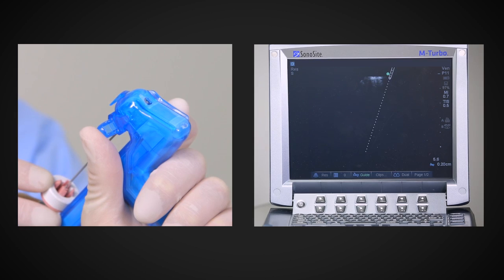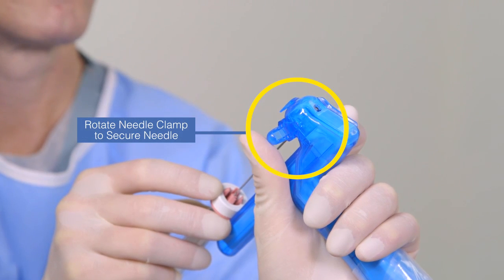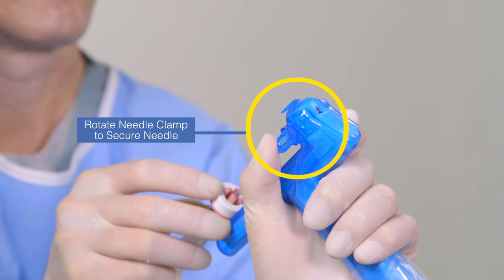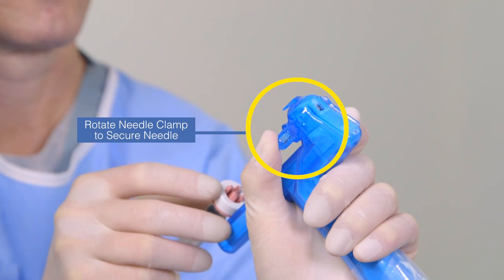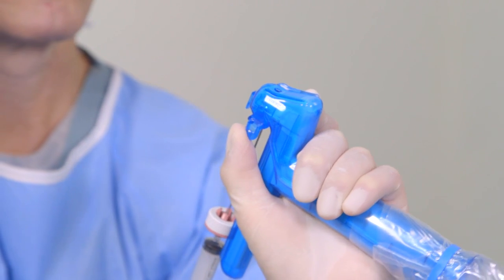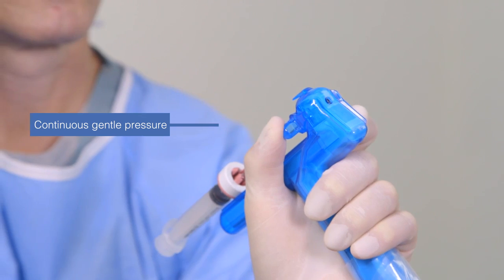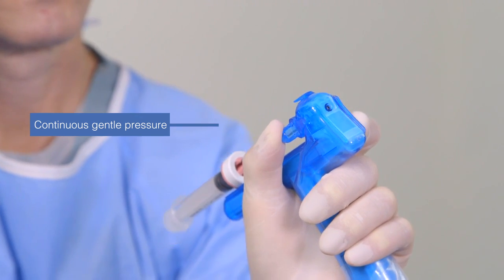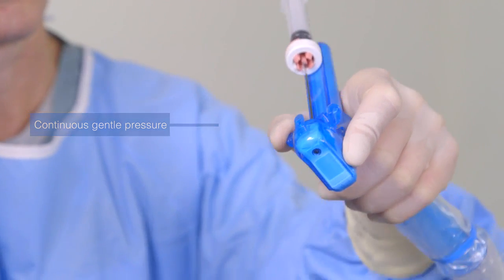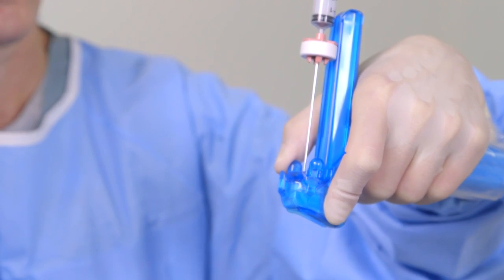At this point, retract the needle slowly until the virtual needle just barely disappears from the sonogram. Then secure the needle in place by rotating the needle clamp backward with your thumb to the closed position. Check to be sure that the needle tip is not protruding from the bottom of the sterile shield. Hold continuous gentle pressure on the needle clamp to maintain the needle in its safe, retracted position during patient scanning and until you are ready to advance the needle toward its target.